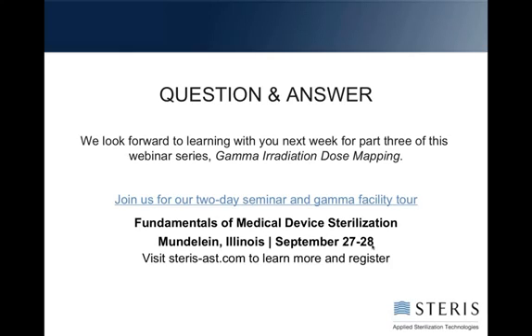How is bacterial endotoxin or LAL testing with every lot you produce different from the quarterly dose audits? Okay. LAL is not related to dose setting or to your sterility assurance level. It's to monitor the presence of a particular type of protein that comes from certain types of organisms. It's related to the cause of a pyrogenic effect in humans. So if your product is labeled, for example, pyrogen-free, or is used in a situation where that type of organism being present could be severely damaging to a patient, you are required to test every lot you make for endotoxin.